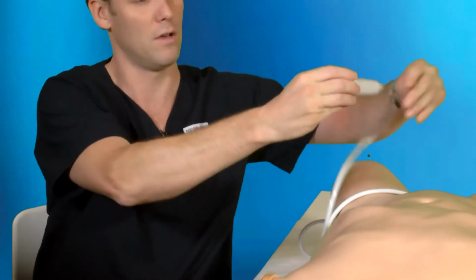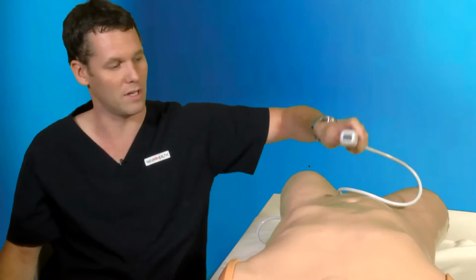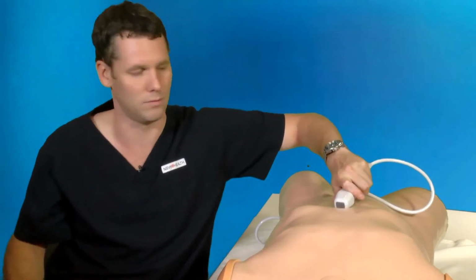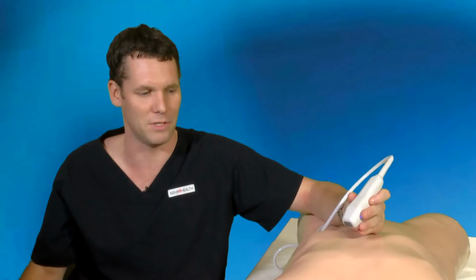And then finally, with the imaging dot pointing towards the patient's left, we put it in the subcostal position and fan underneath the sternal edge, and that's called the substernal view. So we'll talk about each of those views in turn, and I'll try and describe, using Bob, how to get some of these images.